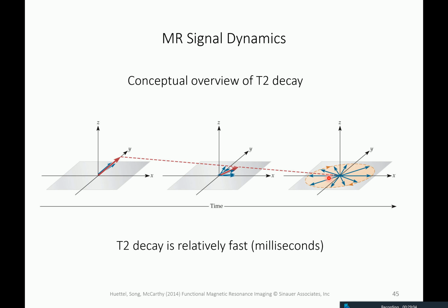Yeah, that's a good point, at the time scale that we are looking at here, yes. Actually, I will show you in the end a picture that shows the combined effect. But what we are looking at here happens within a few milliseconds after the excitation, so let's say 40 milliseconds, or let's say 100 milliseconds.